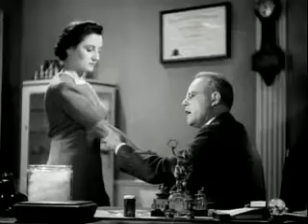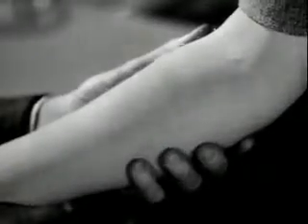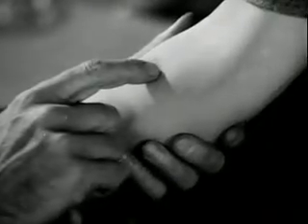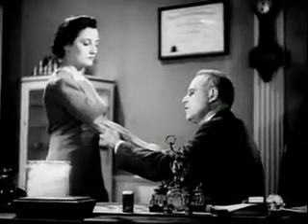A positive reaction is one that shows edema and redness of varying degree. If there's no edema, the reaction should be considered negative. When in doubt, pass the finger over the tested area. Sometimes the induration can be felt when it cannot be seen.